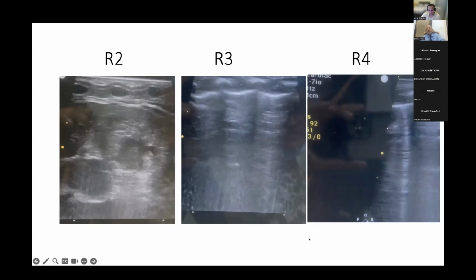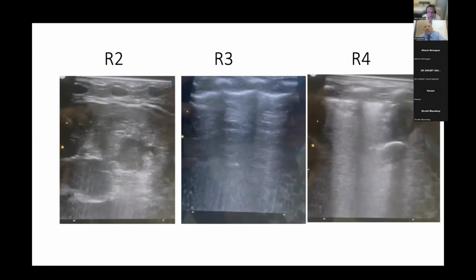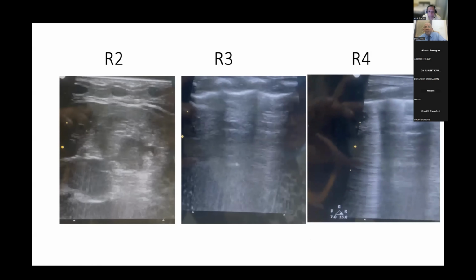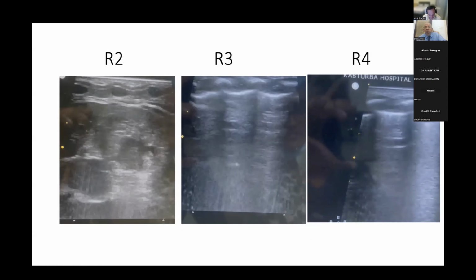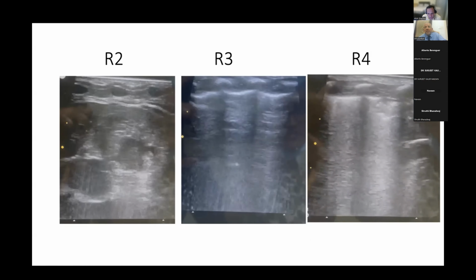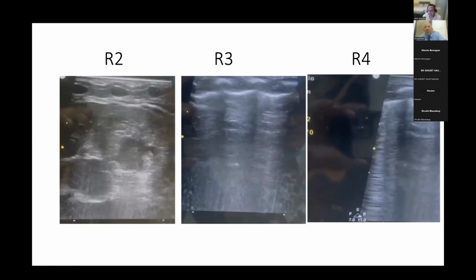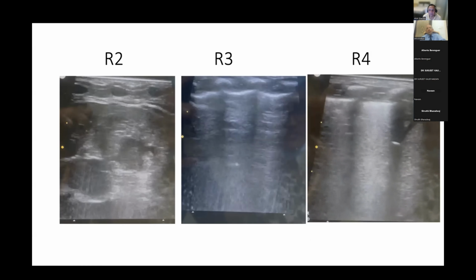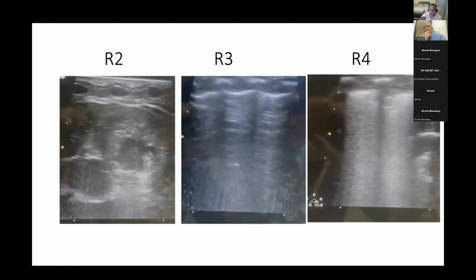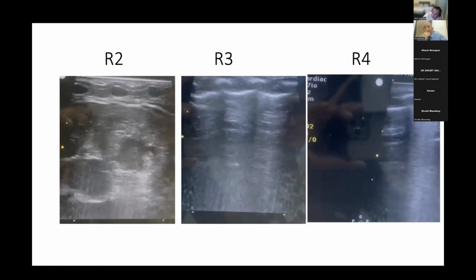So if this baby had this kind of an appearance, what would you be thinking of? Shruti, what are your differentials? So this is collapse consolidation secondary to infection, because clearly the way the baby presented and also the other biological parameters, the microbiology parameters, everything. But if I had just intubated this baby, what do we think? If I said I've just tubed this baby, it's too much on the right. Yeah, I would really think of a right endobronchial intubation because your heart is pulled, with a significant loss of the lobes on the right side, pulling the heart.